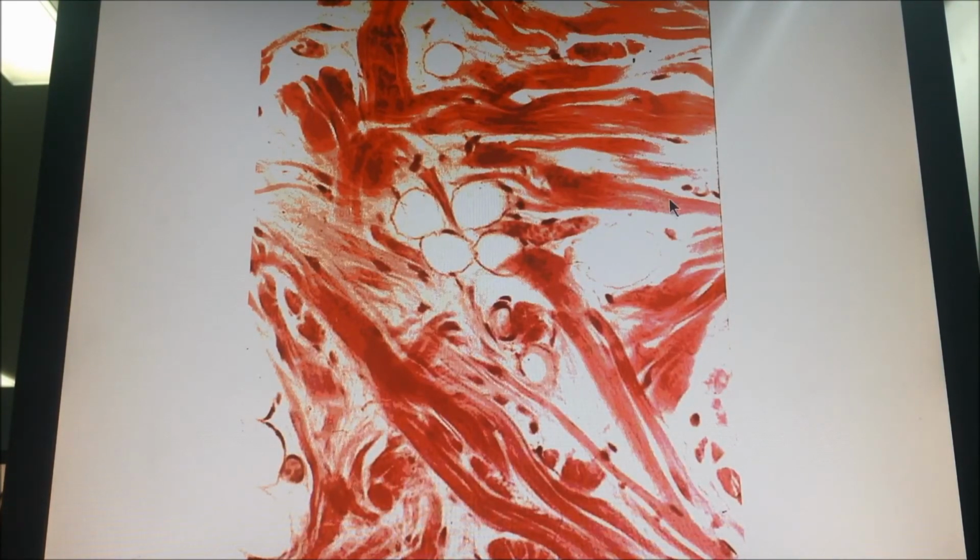نيجي هلا هون. This is obviously a connective tissue. Bundles of collagen. There is no تباعد بين الفايبرز, meaning this is not a loose connective tissue. This is a dense connective tissue. So the first thing you judge by is the collagen. Bundles of collagen means it's dense, not loose.